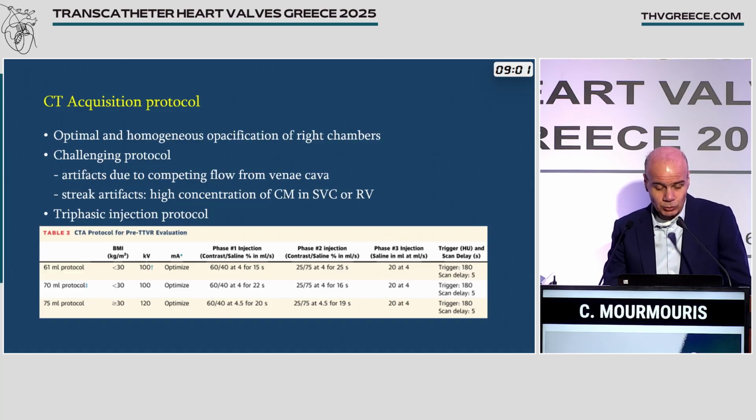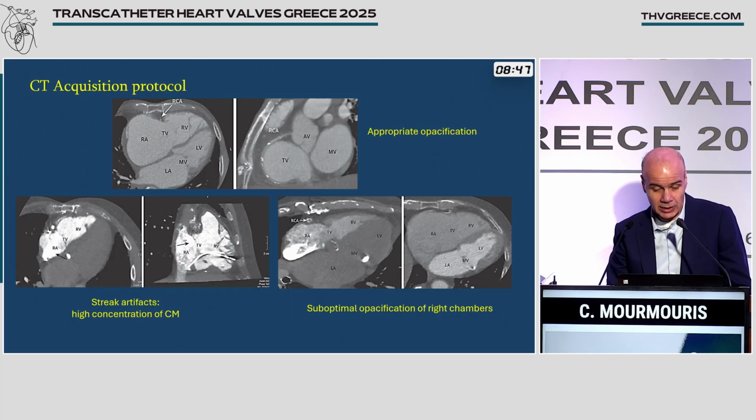So we need to perform a triphasic injection protocol. This is a protocol where we inject to the patient different mixtures of contrast medium and saline in order to avoid all these artifacts.